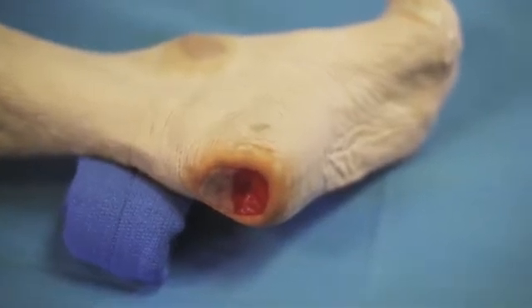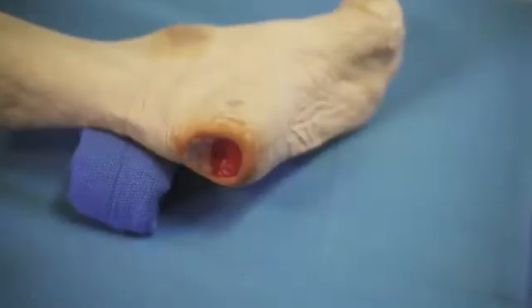For wounds on the plantar surface or the heel of the foot, it's sometimes beneficial to apply the dressing in a way that positions the tubing and the center track pad on the dorsum of the foot away from the wound. This bridging technique helps to minimize the chance of creating additional pressure points. Let's see how to do it.